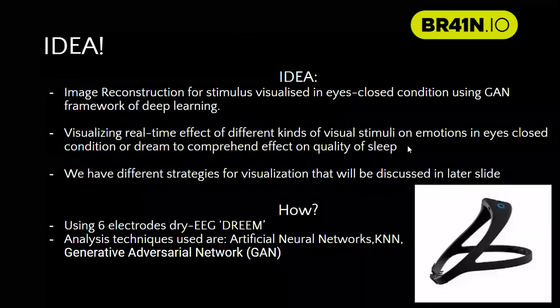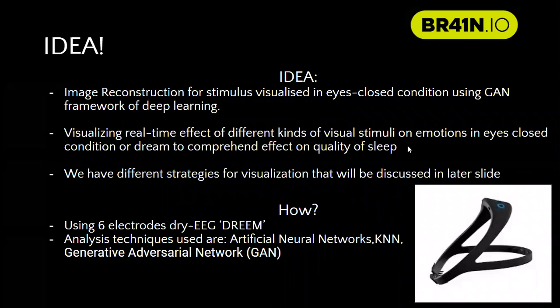Our idea is to reconstruct the stimuli of a person with the help of a Generative Adversarial Network, which is a deep learning framework. So how will we do that? We have an EEG dream device, and we will be collecting the data through that device. I'll explain all the things later.